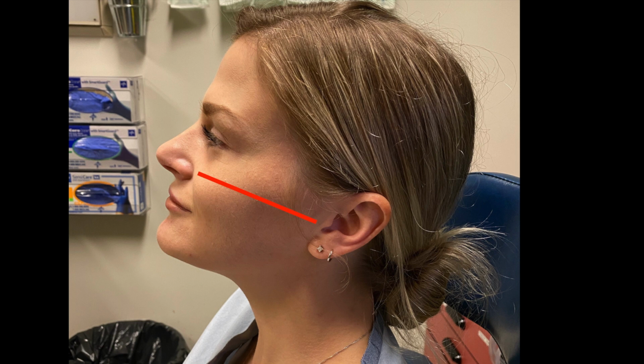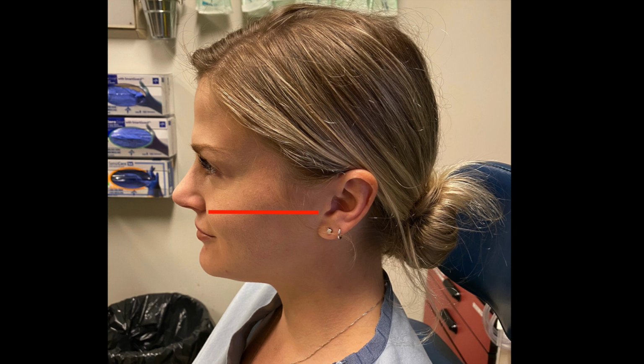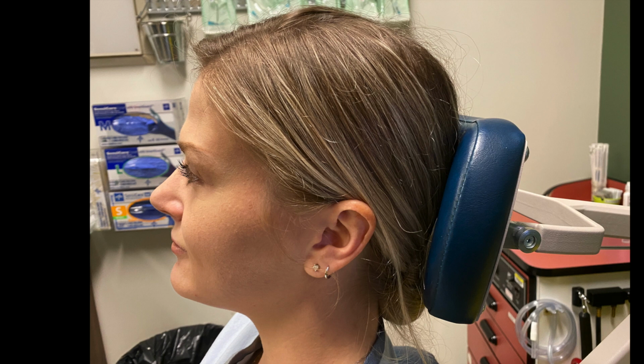The nasal cavity may be most accessible with the patient's head tilted slightly upward. However, the best position is to be determined by the person performing the swab. As illustrated by the red line, the patient's palate position will change with their head position. Therefore, the ideal position is whichever position provides easiest access to the nasal cavity for the person performing the swab. Regardless of the selected position, it is important that the patient's head is against a headrest to avoid movement during the procedure.